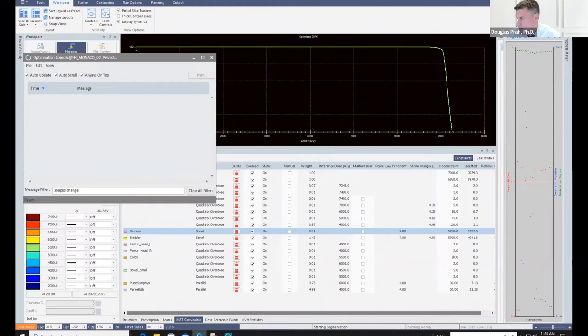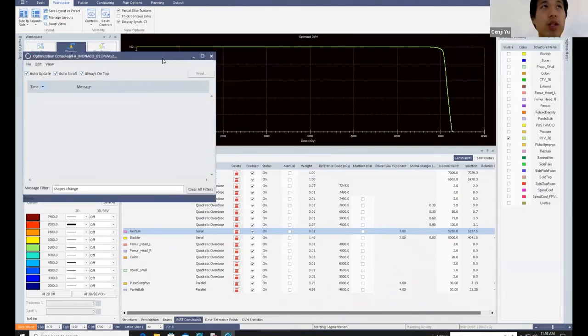I see someone is asking about using Pareto for SBRT or SRS. My personal practice is for SBRT, I usually run stage one and stage two constrained MCO because I don't care about the shoulder. So for SBRT and SRS, where you don't care about max point doses, constrained with MCO on in stage one and two. Adi, would you like to just say it because you have your hand up?